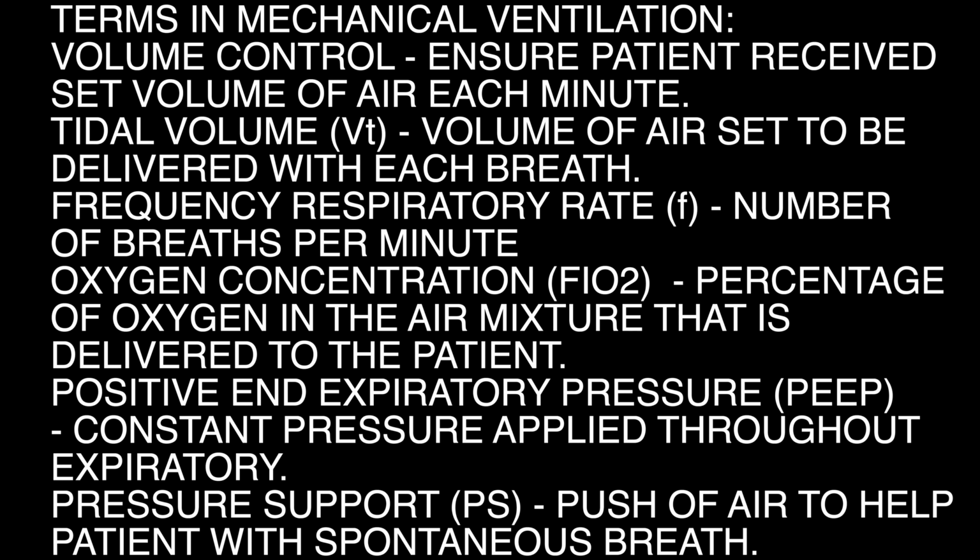Tidal volume, VT, is the volume of air set to be delivered with each breath. Frequency, respiratory rate, F, is the number of breaths per minute. Oxygen concentration, FiO2, is the percentage of oxygen in the air mixture that is delivered to the patient. Positive end expiratory pressure, PEEP, is constant pressure applied throughout expiration.